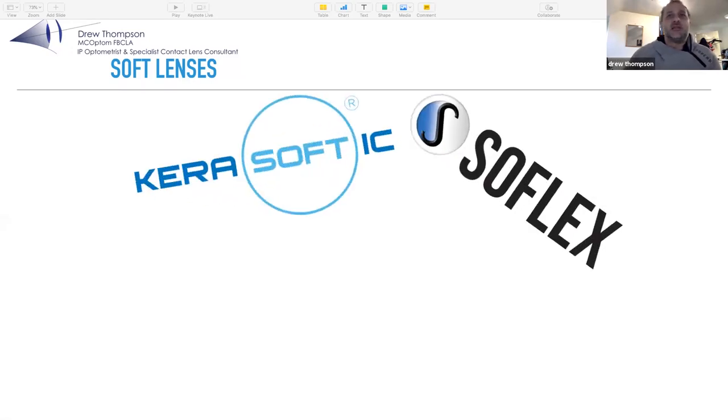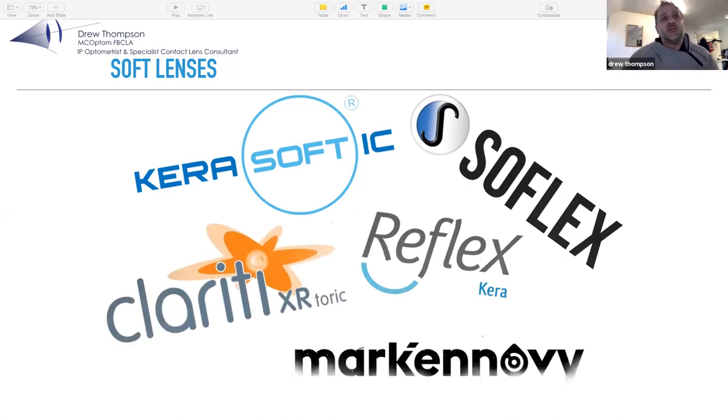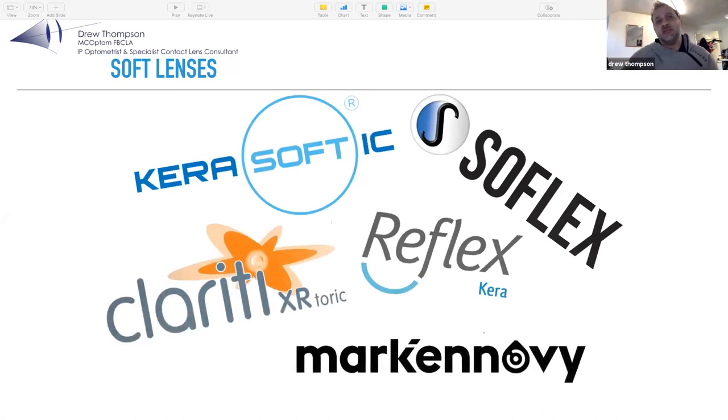So these are some of the brands that we have in the UK that are specifically designed for keratoconic corneas in soft lenses. I use the Kerasoft IC mostly, but you've also got the Reflex Kerat and Soflex. And then we have the Clarity XR Toric and Mark'ennovy, which are standard lenses, but with high astigmatism ranges.